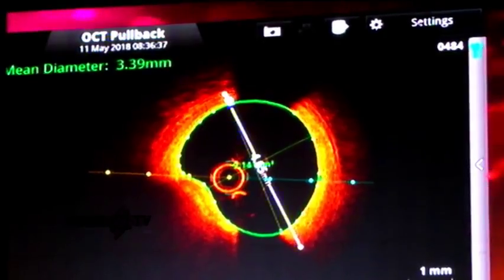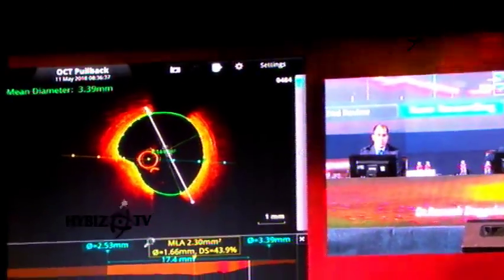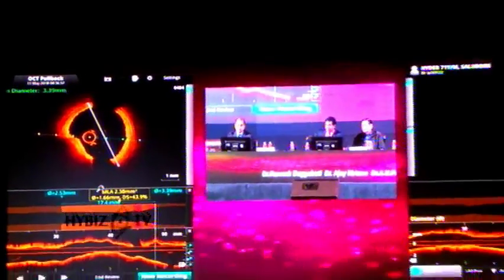Okay. So we'll go ahead and change to 3.5 and first dilate it 4 or 4.5 and then take the OCT. 18.